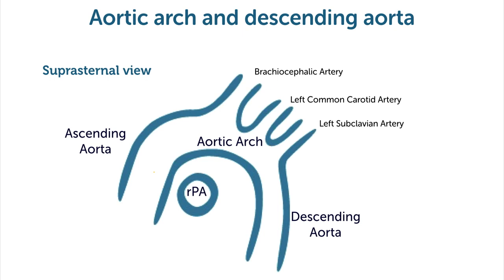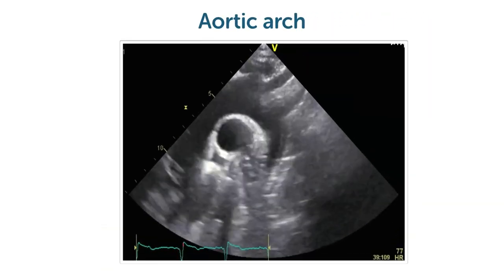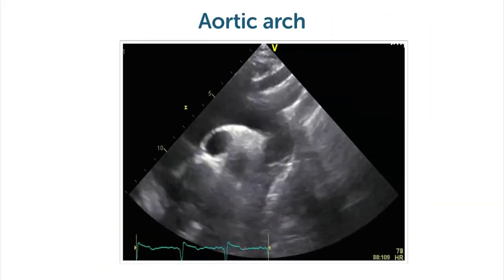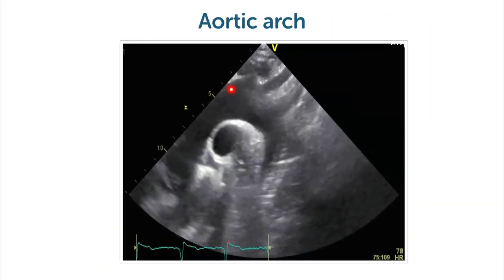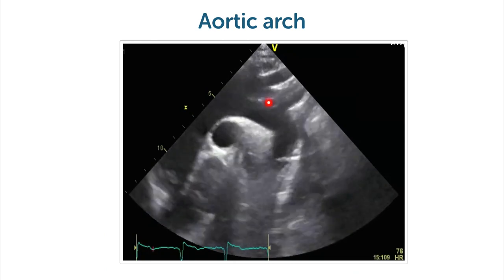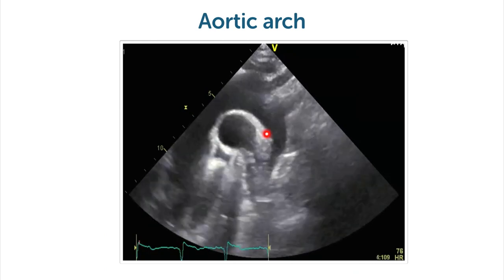Here we can also measure — for example here or here — and sometimes we're even able to measure parts of the descending aorta. This is the view that we will get: the aortic arch right here, with the ascending aorta, the arch itself, and the descending aorta.